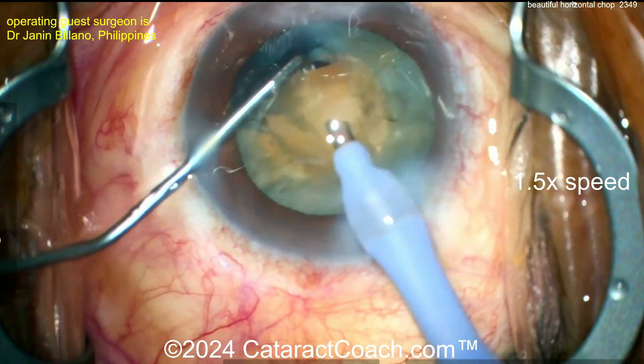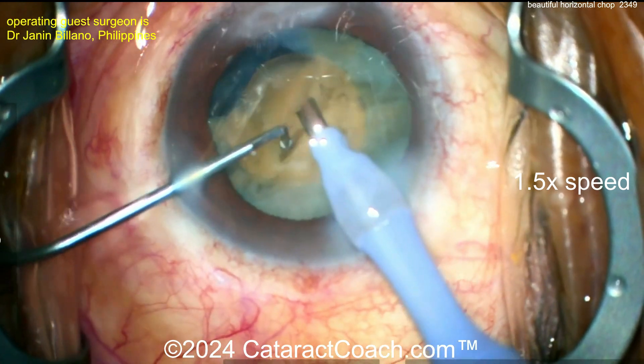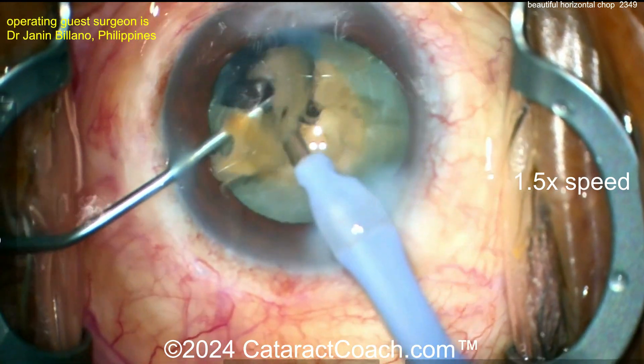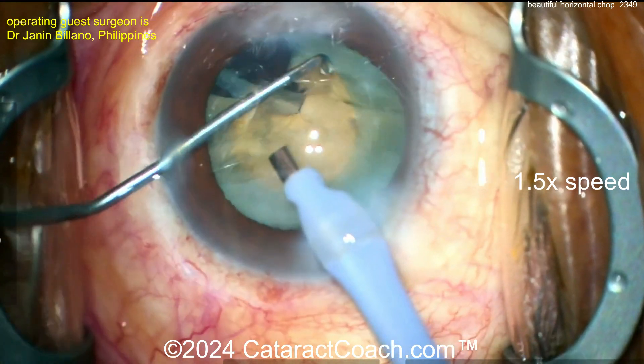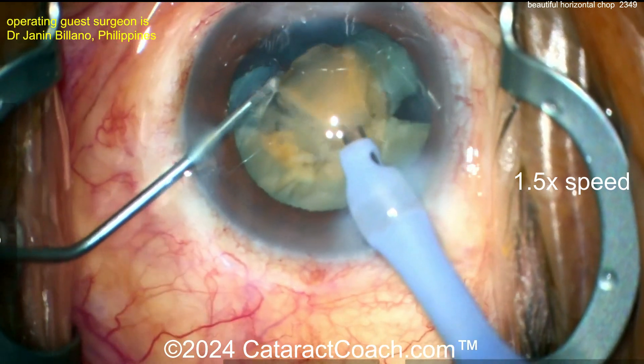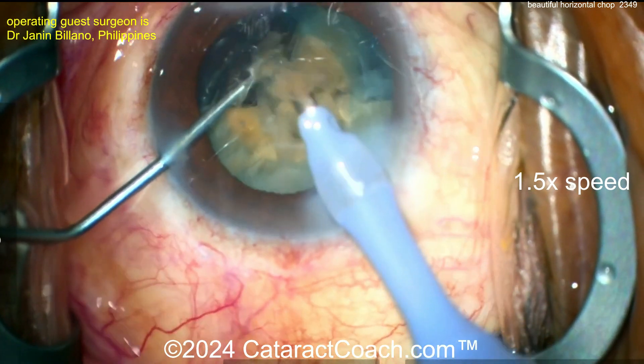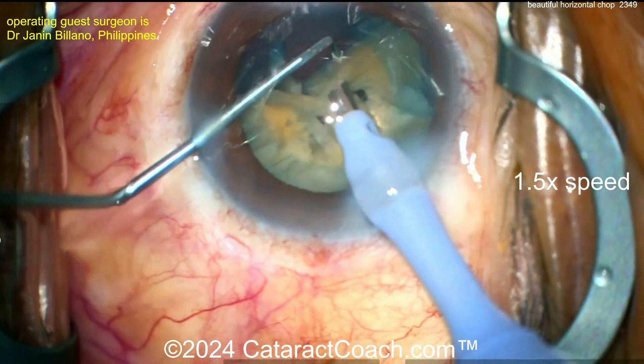Then you can split the pieces and propagate that chop that you did initially fully through the nucleus so it's fully separated. Remember, if there's even a little attachment point on one of these nuclear quadrants, it's not going to come up — if it's still attached, it won't come up. So you need to fully free it, and then look — these come out easy, easy. Very nicely done getting these pieces out.